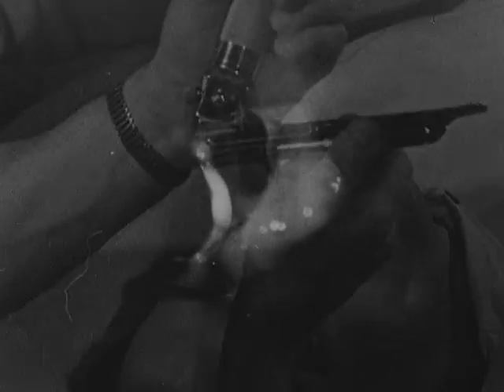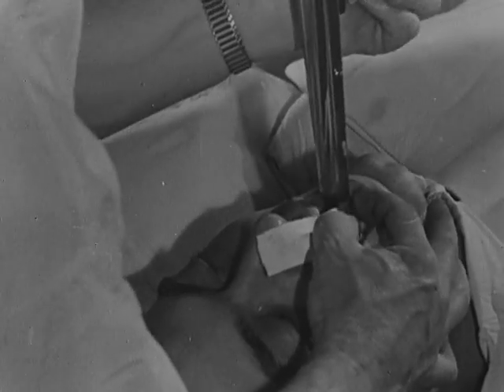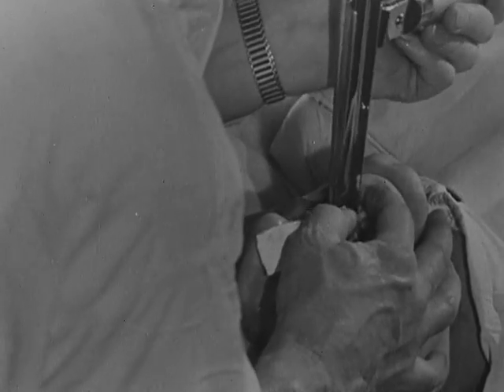The cords are in apposition, with the false cords also coming across. On no account should the anesthetist try to intubate when the glottis is closed, as attempts to force a passage only lead to spasm, besides damaging the mucous membranes. When the glottis is open, the cords are abducted and the tracheal rings can be seen beyond. Once this view has been obtained, the tube can be slipped through the open glottis into the trachea. Watch for these landmarks closely as you insert the laryngoscope.